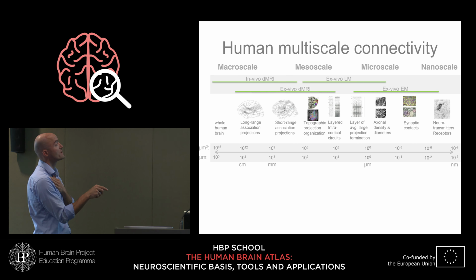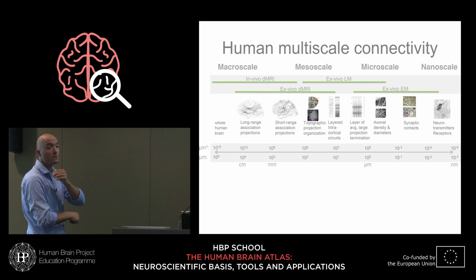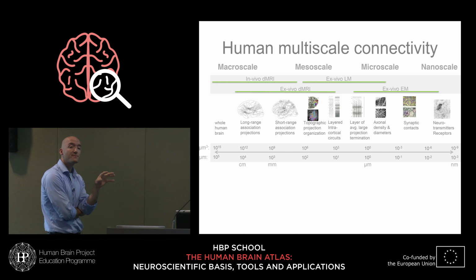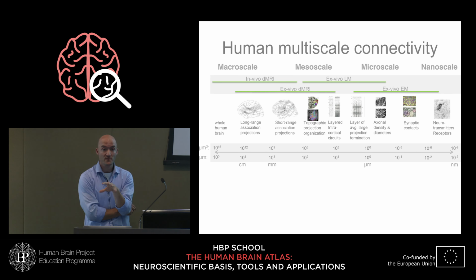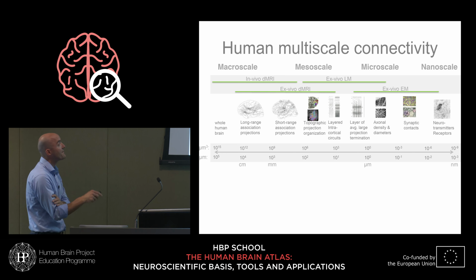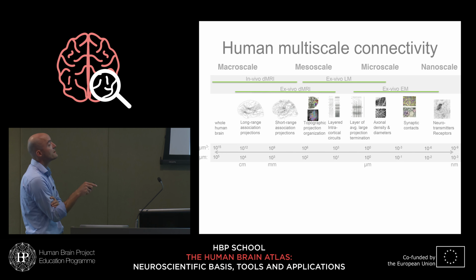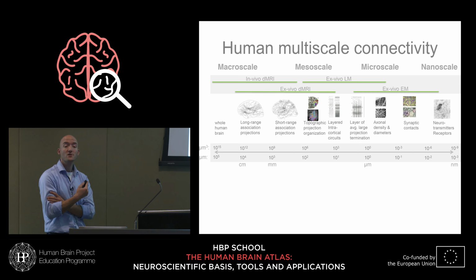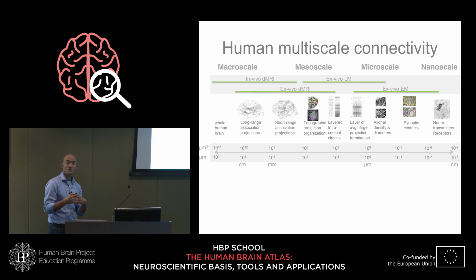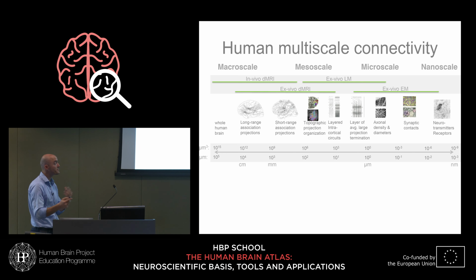Ex vivo diffusion-weighted MRI, what I will focus on a lot today in the first part of the talk, however, might have access to it. I don't have concrete examples of that to show you. I'm just saying that this is one connectivity phenomenon at the mesoscale that requires higher resolution and that justifies trying to get much higher than 1 millimeter isotropic resolution, first to do that ex vivo, then to see perhaps whether it's translatable to in vivo.